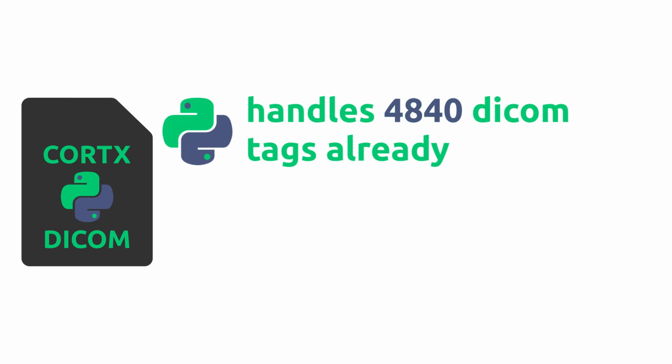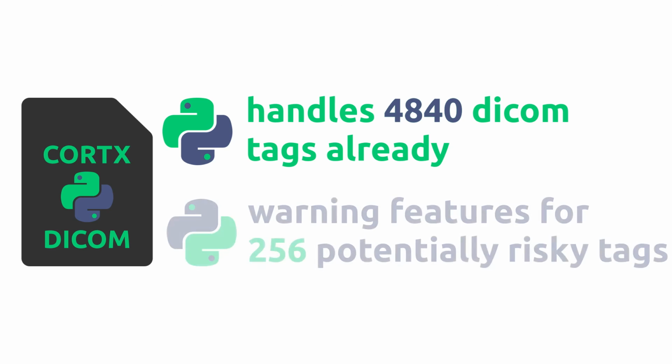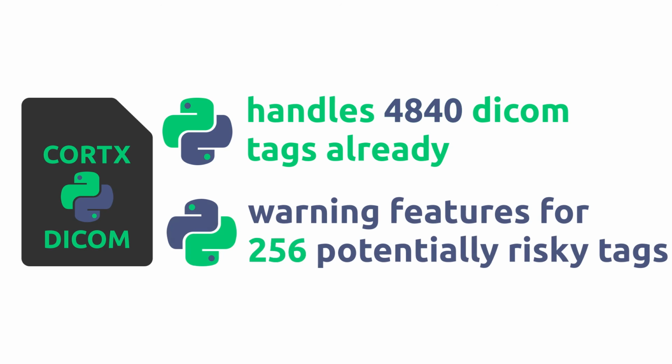Our solution handles the mostly used DICOM tags. We already integrated 4,840 tags into our system as the base of the labeling method. For the legal parts, we implemented the warning features for 256 potentially risky tags.